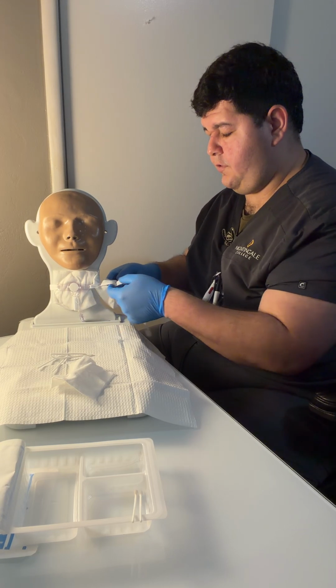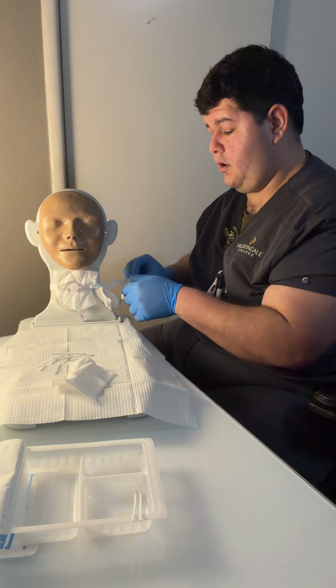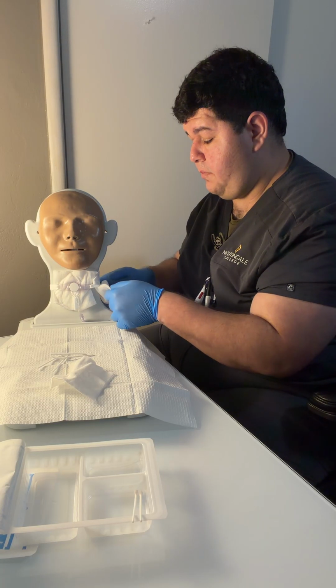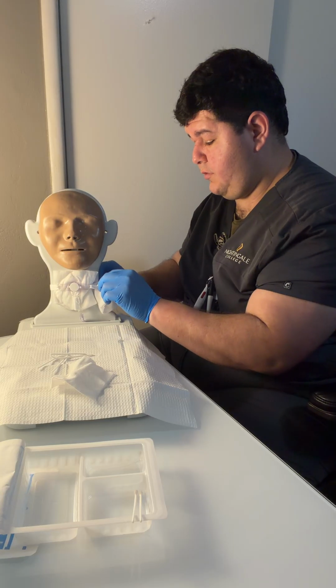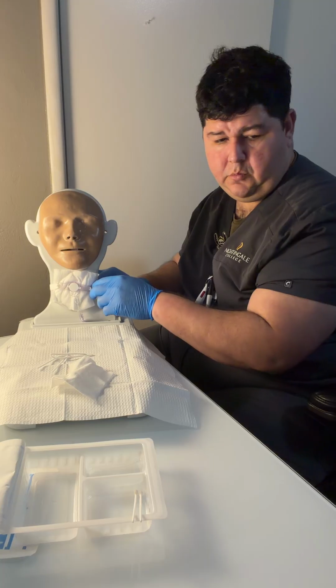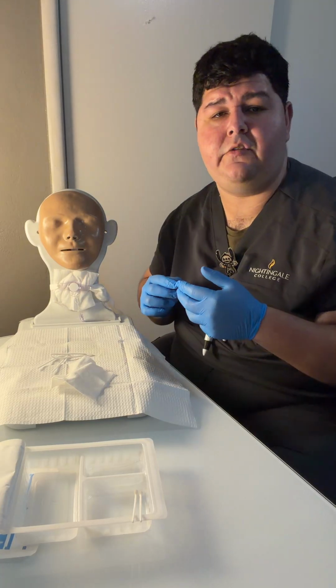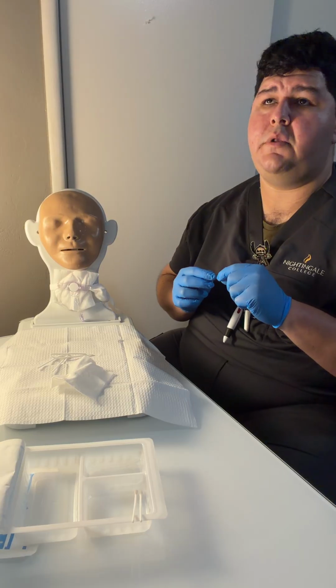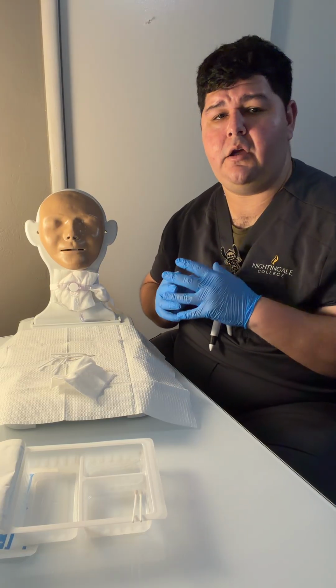These excess pieces of string, of tie, I can cut if need be, and then just go ahead and place the gauze over that tie portion and make it look nice and presentable. If need be, I can add a piece of tape, and then the tape goes on the 4x4 itself, not on the patient's skin, and that is to provide comfort.